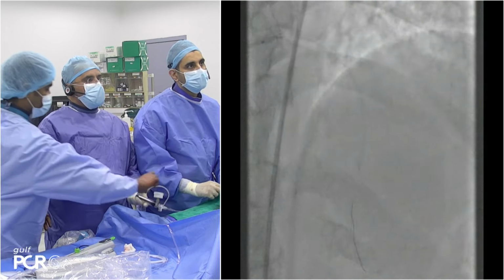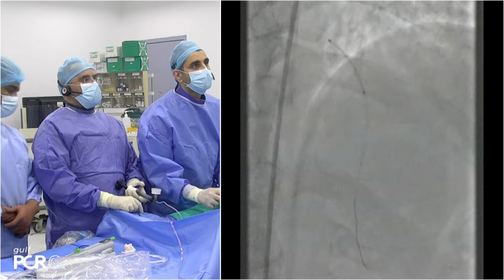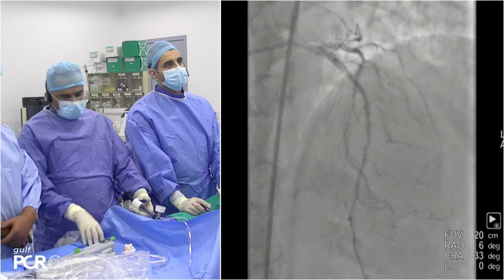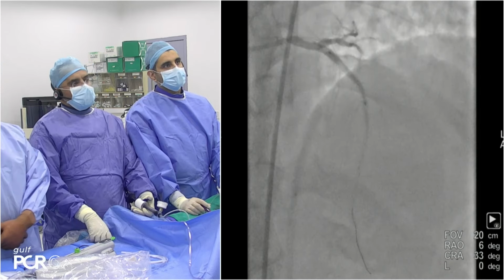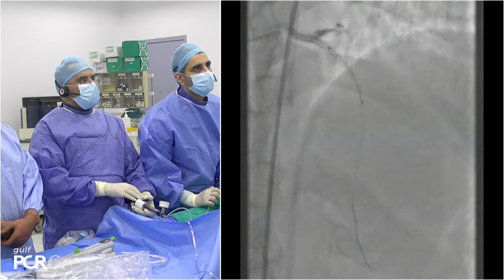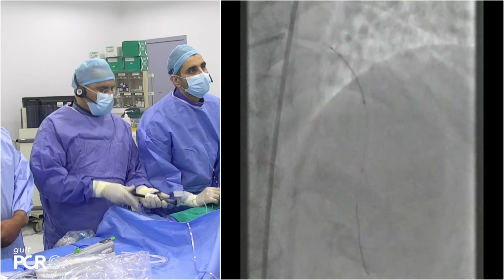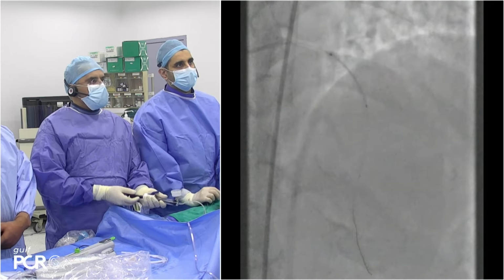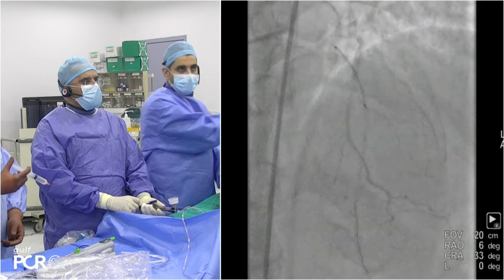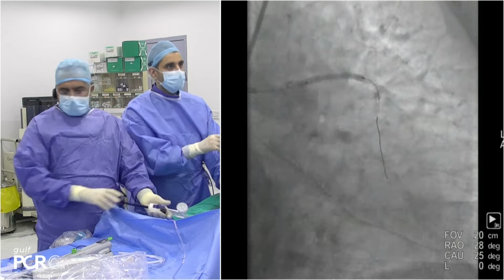Okay, thank you, Julio. Just one more question for you. What would your next additional technique be? So, number one, take an ACT. ACT was already suggested. There are plenty of small white thrombi forming. This is point number one. Number two, because we already explored atherectomy, I think that IVL could be the only technology to be tested without pushing too much with the balloon. But anyway, if you want to push with the balloon, we must know the EEL to know the maximum that we can reach without rupturing the vessel. That is crucial information. Would you do more orbital? Well, higher speed could also be, but we needed to do something in addition before stenting.